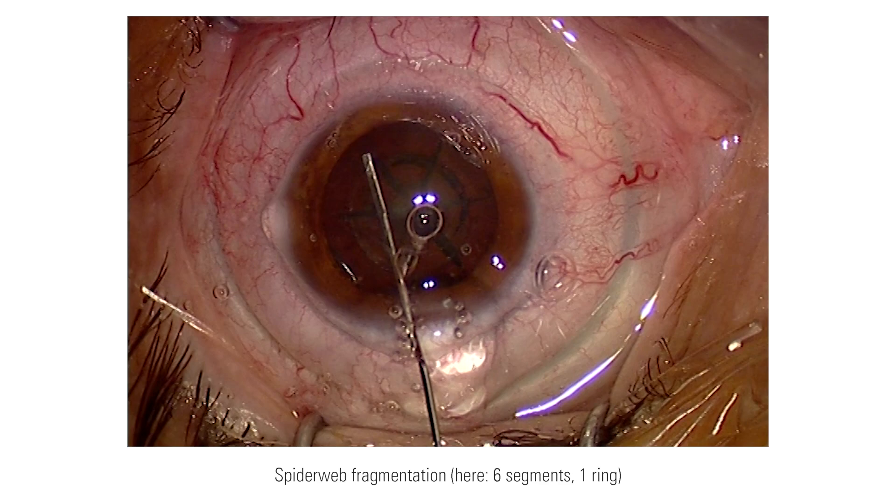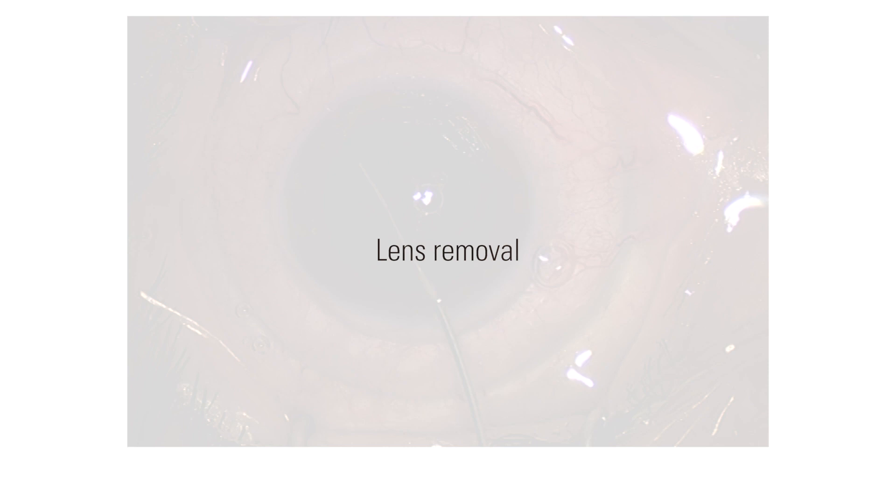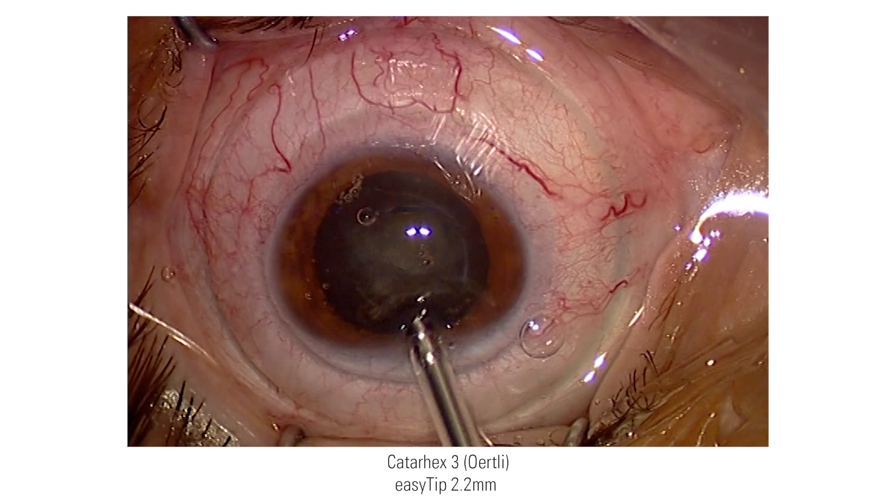During hydrodissection, I used BSS. As a phaco device, I used a Catarhex 3 from Oertli.